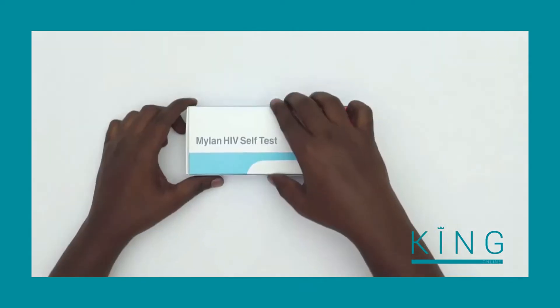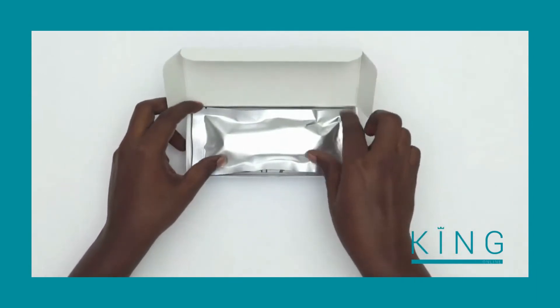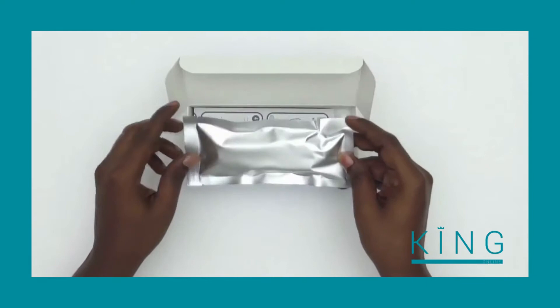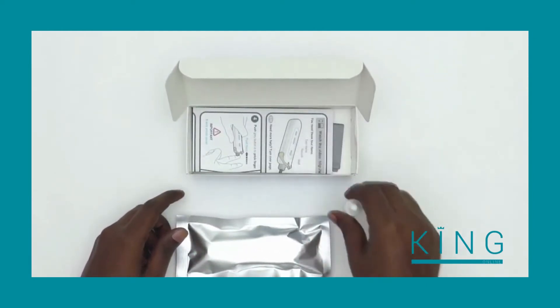As soon as you open your HIV self-test, you will find a foil pouch containing the self-test, a bottle of test fluid, instructions, and a plastic waste bag for discreet disposal.